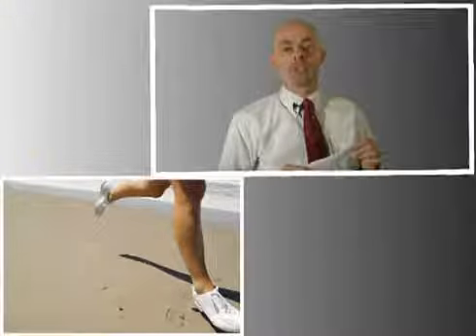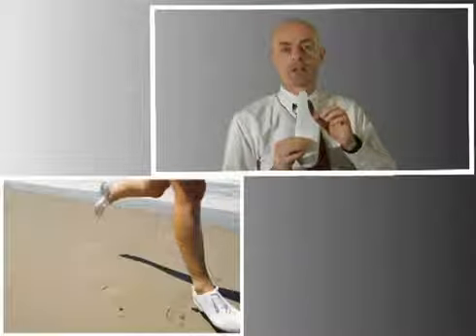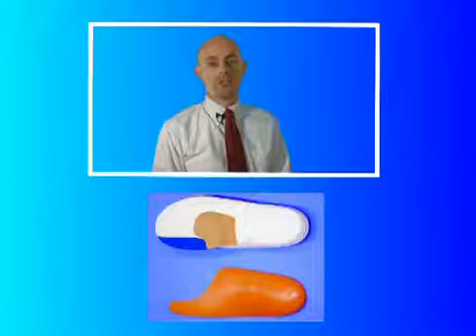A rigid Morton's extension is a foot orthotic where the plastic is extended beyond the metatarsal heads, and it limits motion inside the shoe and reduces range of motion of the forefoot. Sometimes the addition of a rigid Morton's extension to a foot orthotic can exacerbate the condition if it doesn't fully limit range of motion. In those cases, it may be preferable to stiffen the shoe.